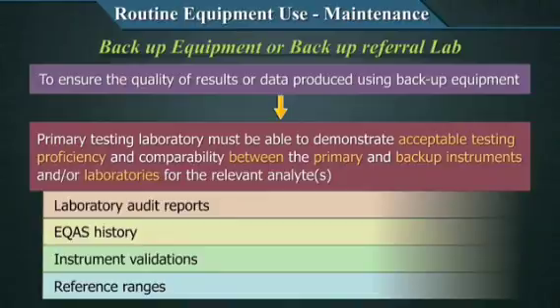So what does that mean? What do you mean by comparability between two equipment or two laboratories? Let me just explain this so that it becomes a practical thing rather than a theory thing. Assume that two laboratories have different reference ranges because they are using two different methods for testing an analyte, and the comparability can be compromised. And the patient and the clinicians may get confused with the results.